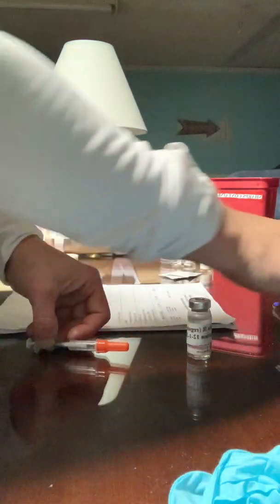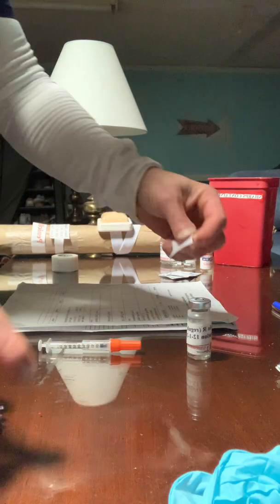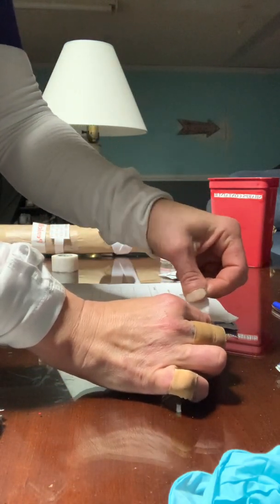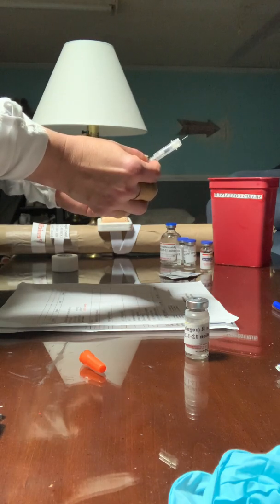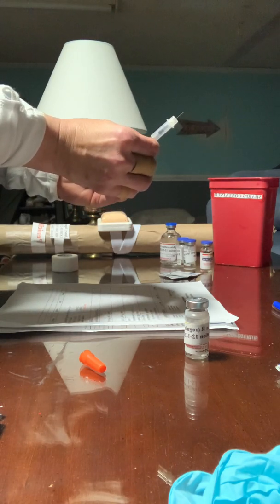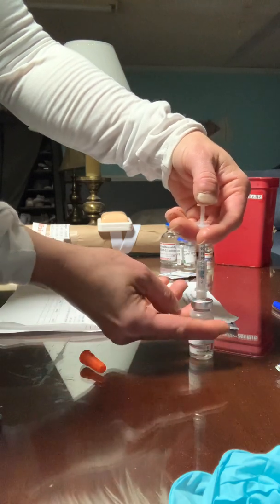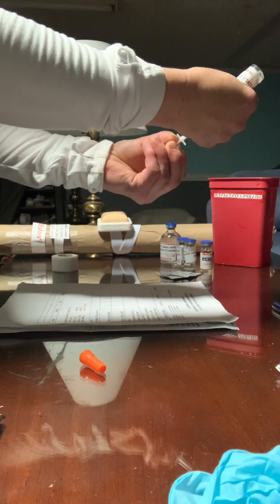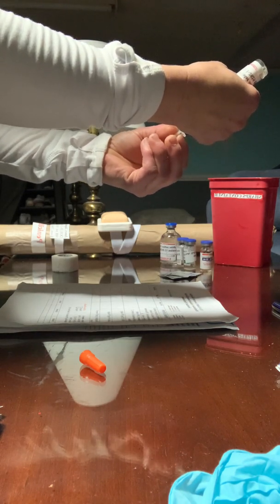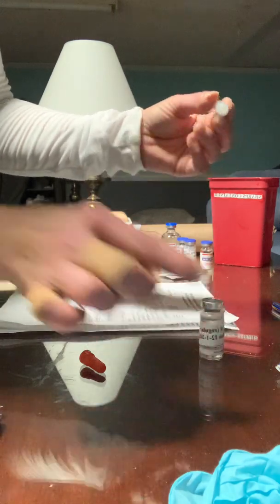Next thing I will do is clean the top of the vial. I would draw back 10 units of air because we are going to be drawing 10 units of insulin. So we are replacing the insulin with air that we will be taking out. I'm injecting the air, and I'll be withdrawing 10 units. I'm going to withdraw a little bit more than 10 units to account for air bubbles.